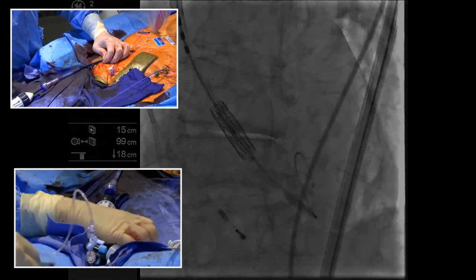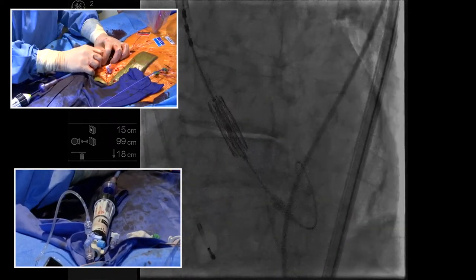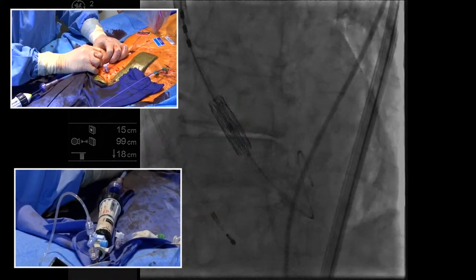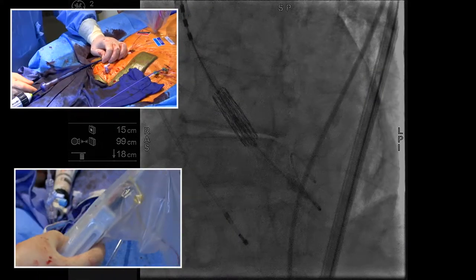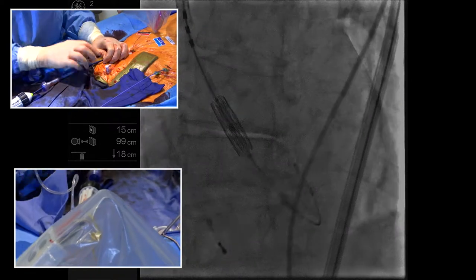Let's do one more test here. Let me just make sure I'm not screwing it up. It's a little low. Yeah, it did drop down a little bit. Pull it back up, get it right back to where we want it. Let's do an integrated run. We're gonna deploy on this one, but I'm gonna inject first, just to be certain. I think it's fine.